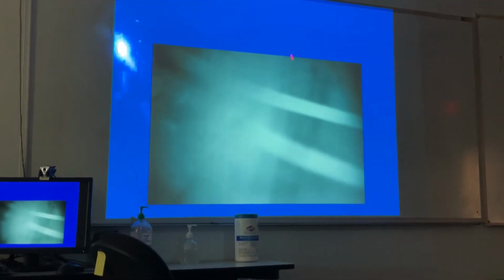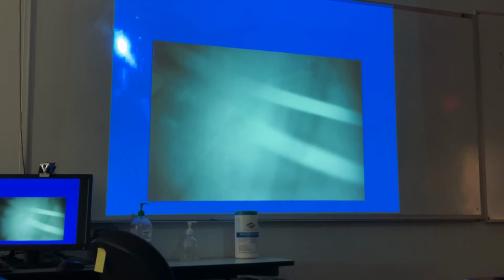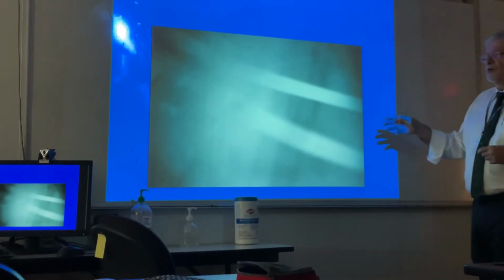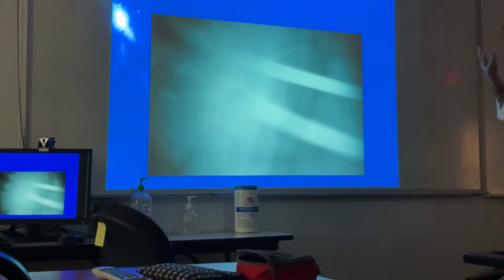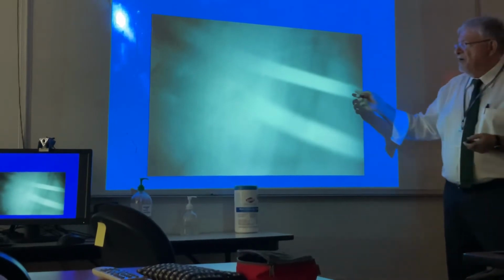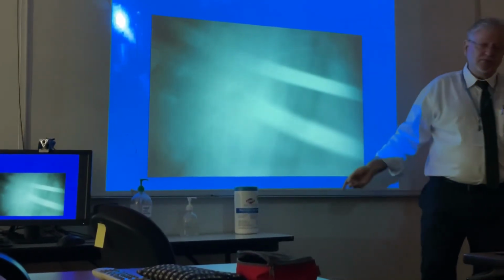Can't tell, this is a lumbar spine, this is a vertebral body, this is an artifact, okay? So in your x-ray suite, you can't have any light coming in. Now, it's less of an issue with the digital system. This guy had a conventional x-ray, and he had every computer in his office connected into his darkroom. You've seen the parade of lights from the computers, okay? That was causing this artifact on all of his lumbar spine x-rays. It took the better part of 2 weeks to figure out what was going on.